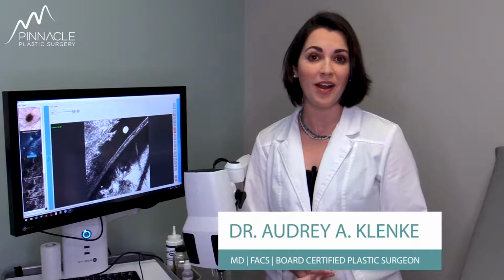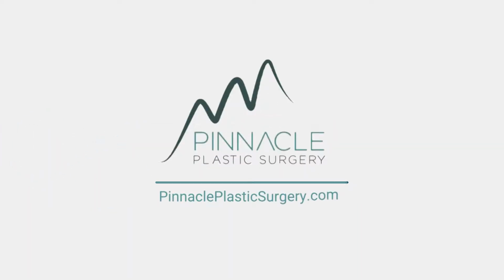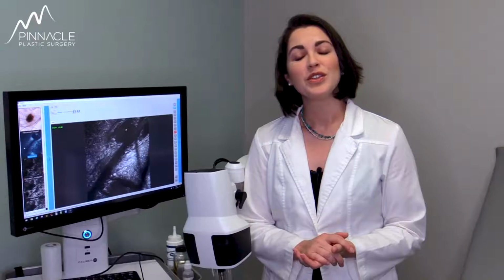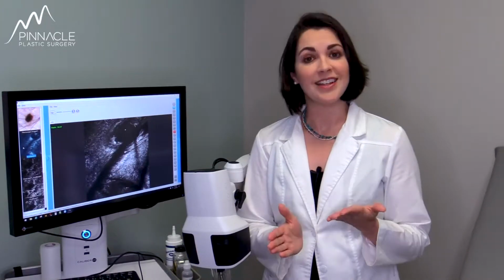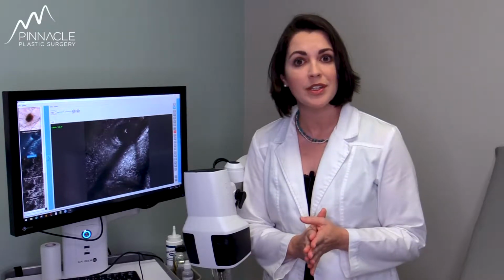Today we're going to talk about confocal microscopy. So confocal microscopy is the latest technology in skin health. It's a way to find out if a skin lesion or a concerning mole is really worrisome or turns out to be nothing.